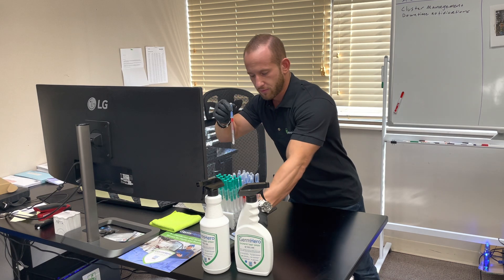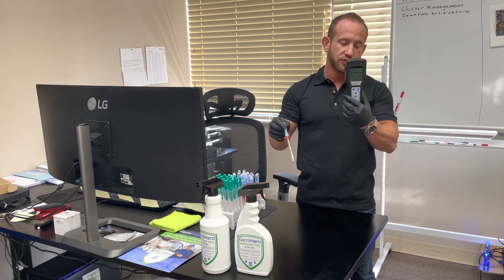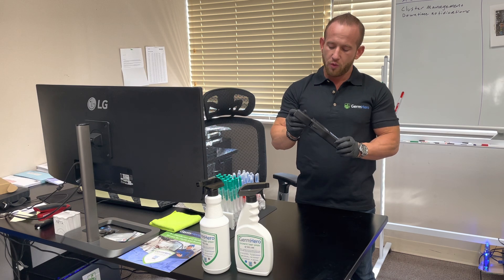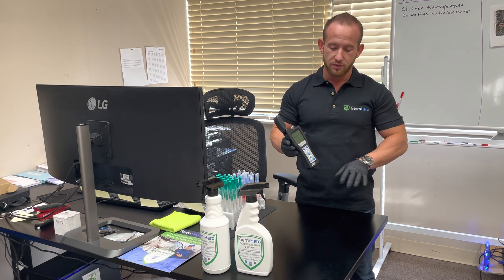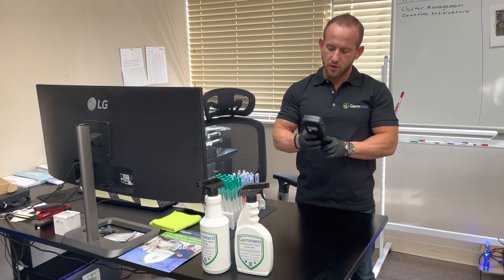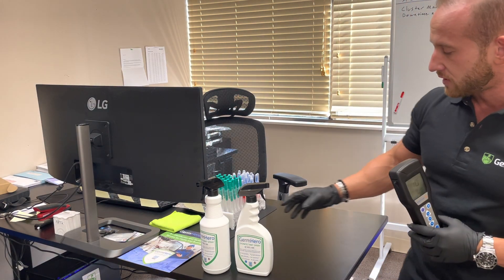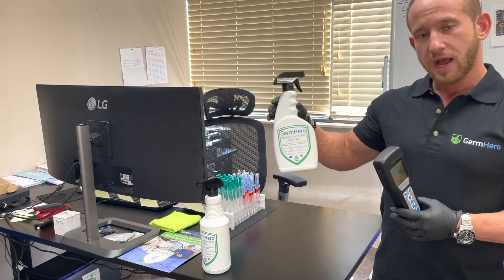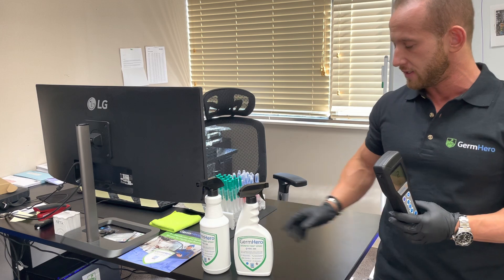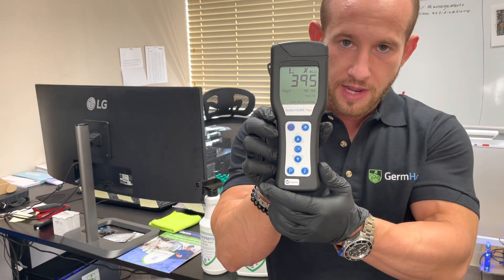Now that we've swabbed that area, we put the swab back and snap the release, which releases the solution into the vial. We'll mix that up a little bit, then take the ATP meter. Once it's nicely mixed, we drop it in. This will give us an RLU measurement in about 15 seconds. Once we get that measurement, I'd like to go ahead and disinfect that surface so we can see just how effective Germ Hero's disinfectant spray really is.